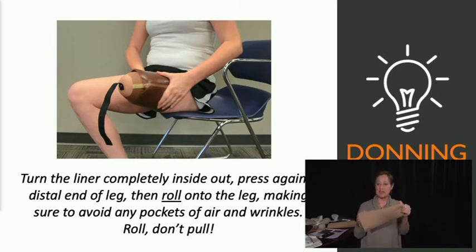Helping them to manage that and also having your OT buddies, maybe this is a reason for them to see the patient. OTs can be working on donning. This is a wonderful task for them. PTs are working on early gait. There's a great relationship there and patients can get a little bit better therapy. So those are the general tips for donning. Roll, don't pull.